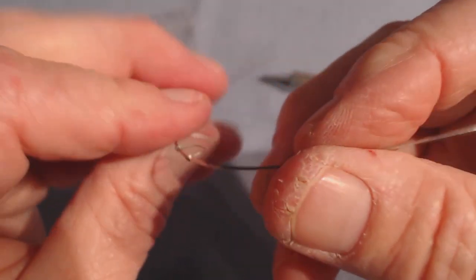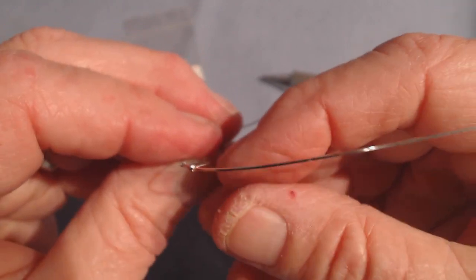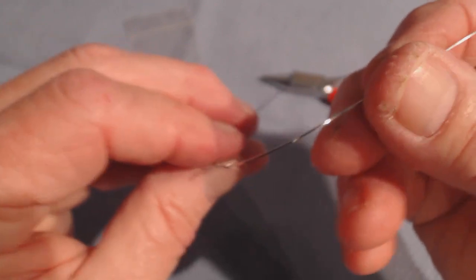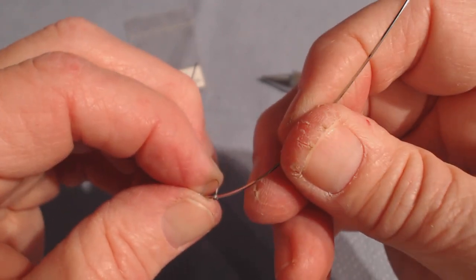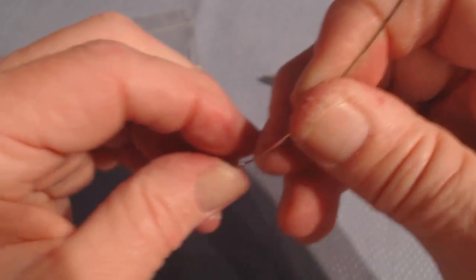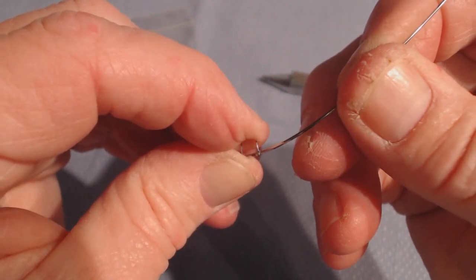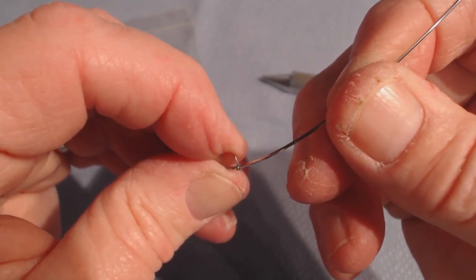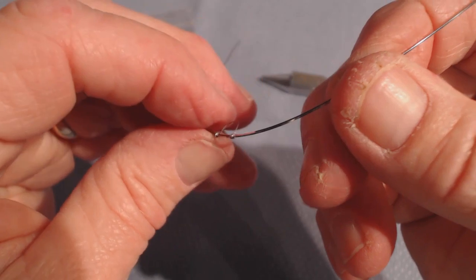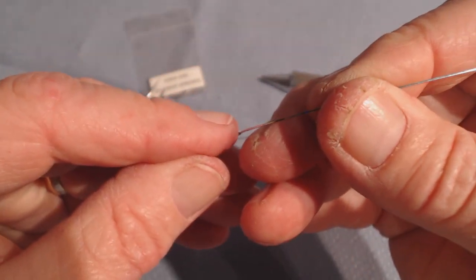And for the installation of this, you slide the arch wire through the molar tubes and everything, and then when you get to the central incisor, you're going to pick this up and wind it up and push this against the central incisor. And it has a tremendous amount of force when you do that, so it's going to want to push the wire out of the slot. So, this must be steel-tied on each individual tooth.